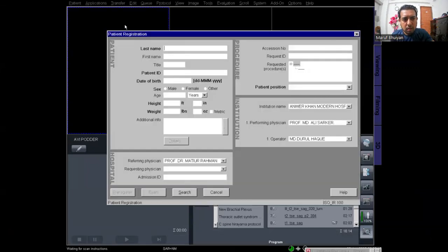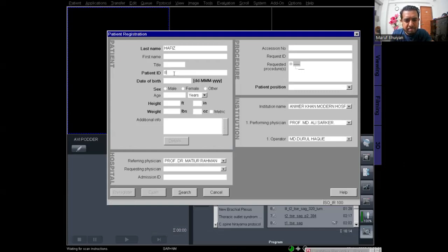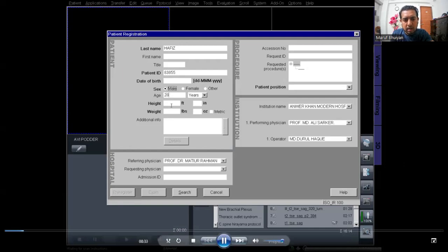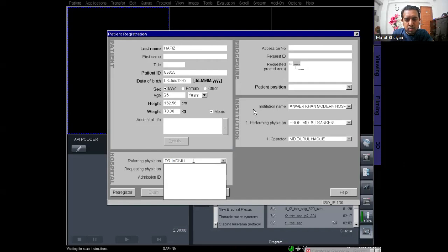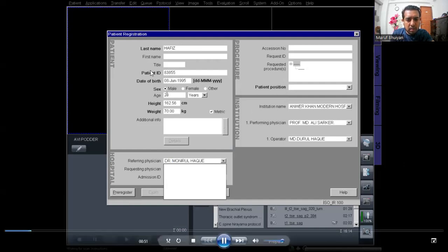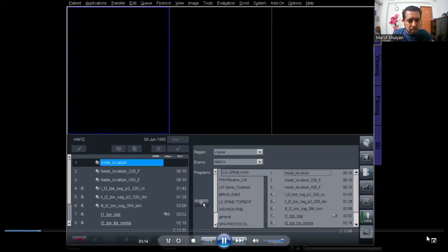First, register the patient — go to Patient and select Register. Enter the name of the patient, then the patient ID, then the sex, then height, and then weight. The referring physician is not compulsory but you can set it. You should fill up the bold letters. The patient position is head-first supine. Now click the Exam and select L-spine, then MMCH, then L-spine — whole spine.